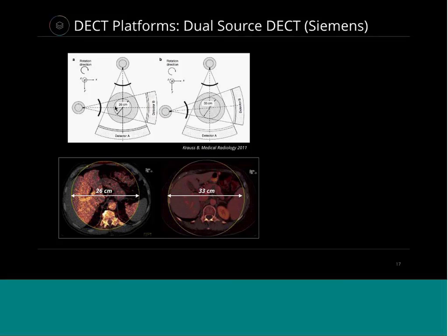So the only time you can have dual energy is when both of these tubes are overlapping, right? A low energy and a high energy. So when you're scanning in low energy and high energy simultaneously, that's where you have overlap, and that's the dual energy field of view. Because one of the tubes is smaller, because you have to fit it in one gantry, that means you've got a limited dual energy CT field of view. That limitation is basically based on whatever the small tube covers, okay?